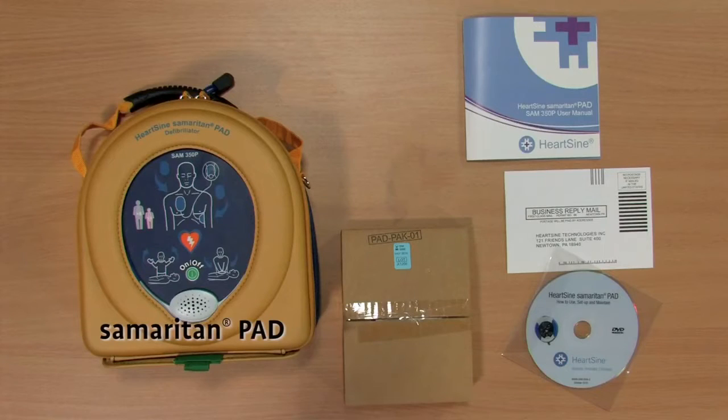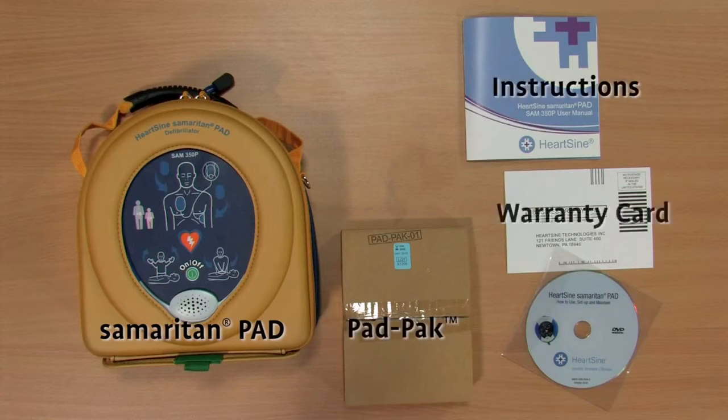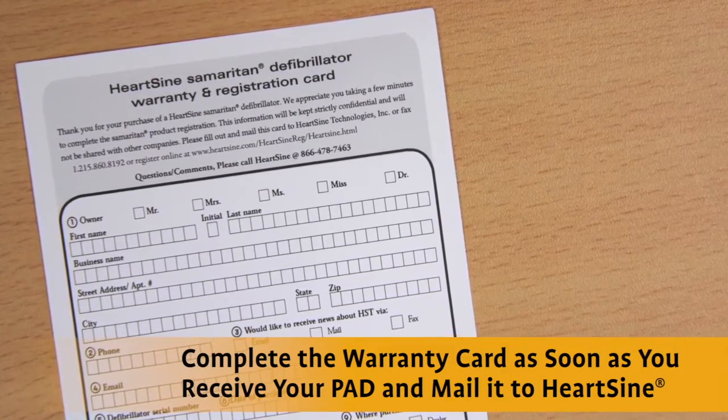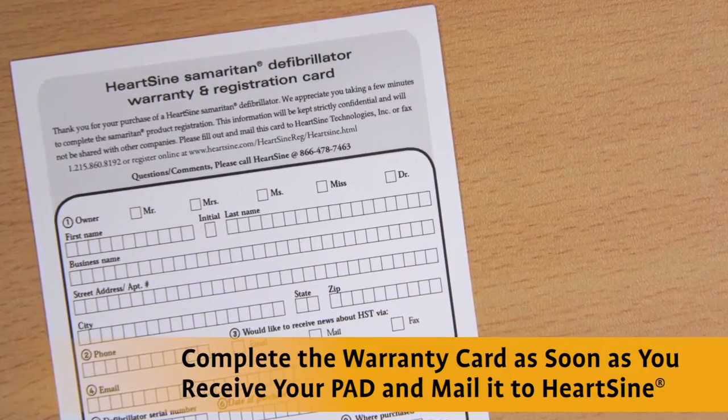To set up the HeartSign Samaritan PAD, simply open the box and remove all the components. Be sure to complete the enclosed warranty card and mail it into HeartSign to activate the 10-year warranty.